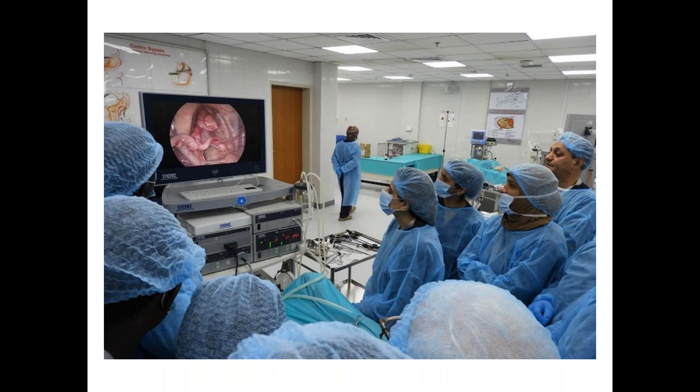Of that 5 millimeter size, there will be a cannula, a blunt tube, and a blunt solid stick passing through this cannula, which has a very pointed tip. So you thrust these instruments, that is the cannula, the hollow tube in which a pointed trocar has been inserted, to go through the abdominal wall to reach the abdomen. Once it reaches the abdomen, you take out that inner solid pointed trocar, and through that hollow tube you put in these slender instruments which are lying on the tray. And then you do your surgery.